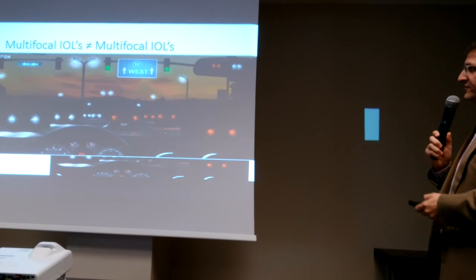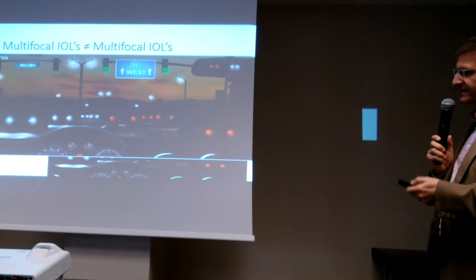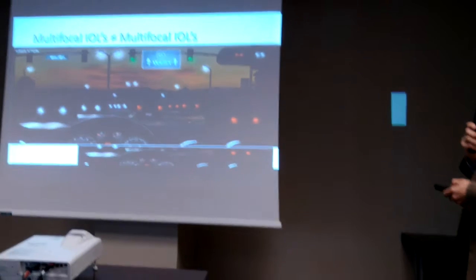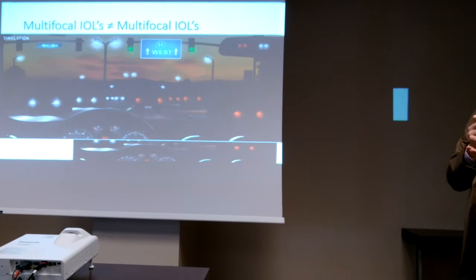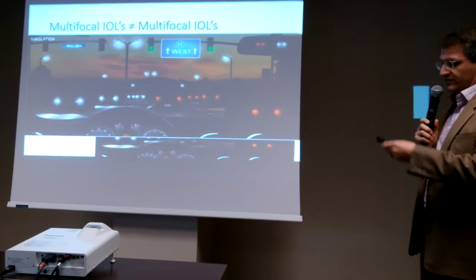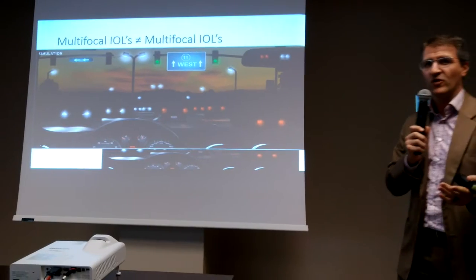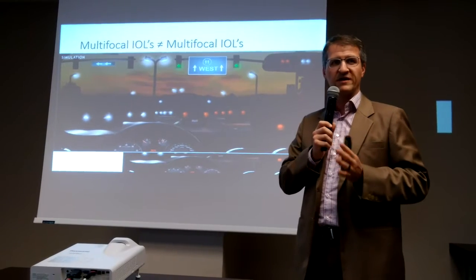And this is a refractive lens. This is the Oculentis MF30, which is a segmented refractive lens, and I think it's quite obvious that halo and glare are not as much of an issue as here. The downside of this lens is probably that the reading performance is slightly lower than with diffractive lenses, but you don't have any dysphotopsia, or much less. And in case they can't read small print, you just provide them with +1 or +1.5 reading glasses, and the problem is solved. So that makes patient management quite easy.